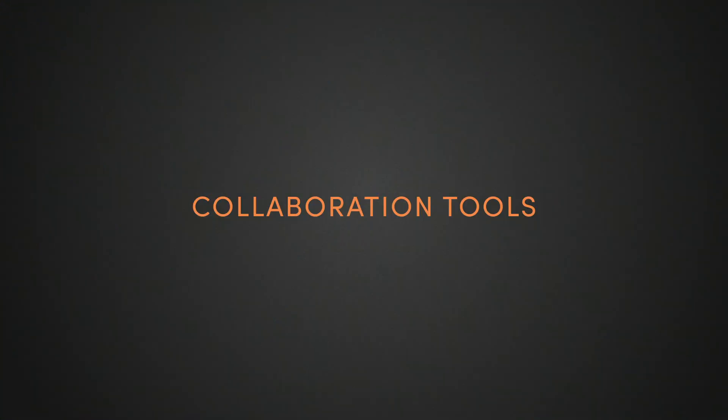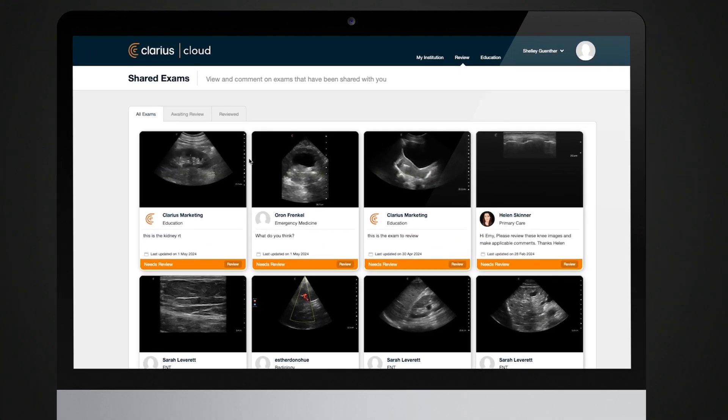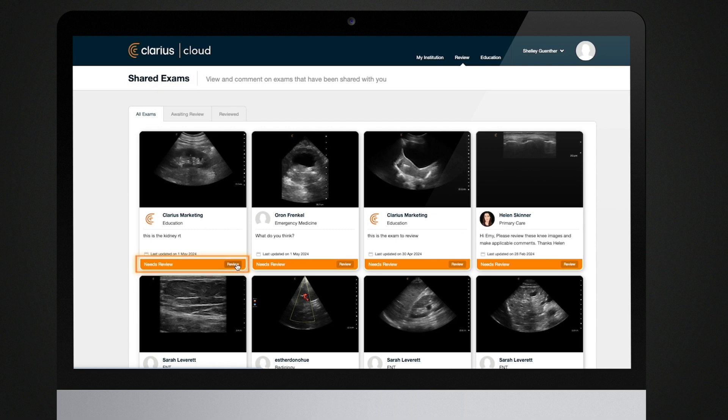Collaboration tools. Clarius Cloud allows you to collaborate with other clinicians or medical staff as part of your workflow.